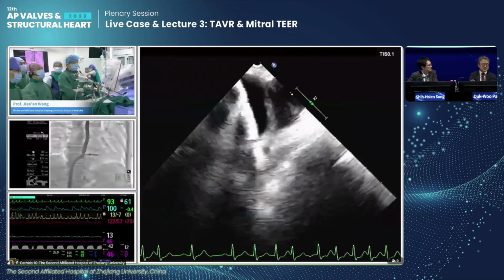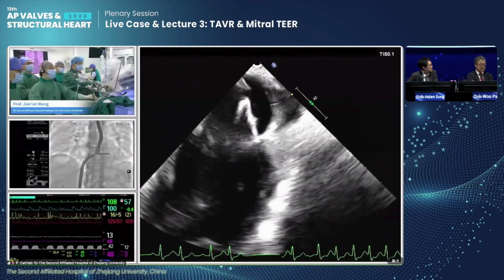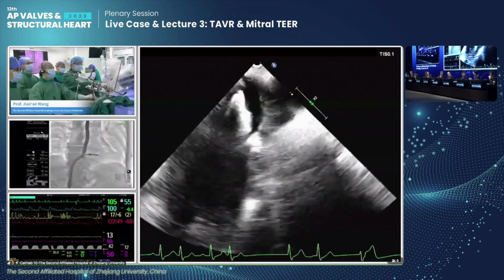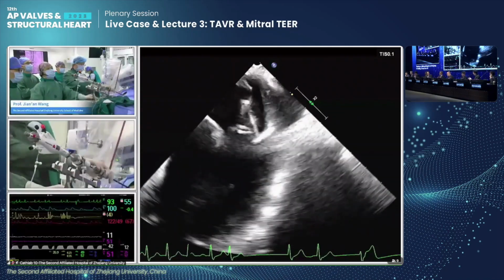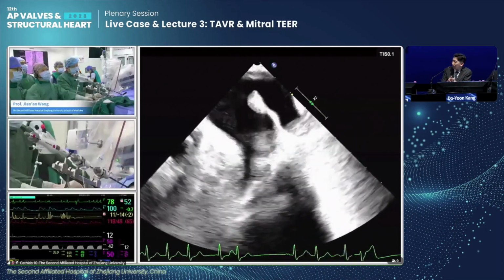Would you also prefer the long arm if the clip length is good enough? Yeah, we are thinking much about that, for the lateral region. But with long clips we have some more complications and some difficulties.